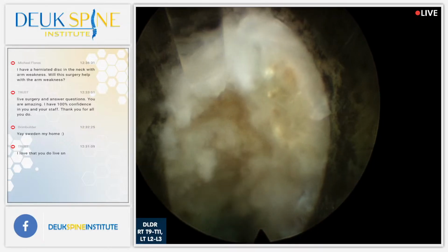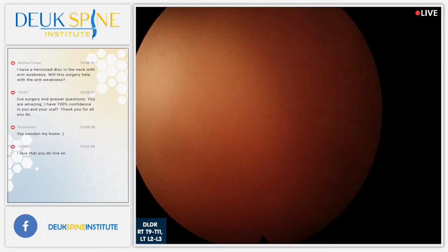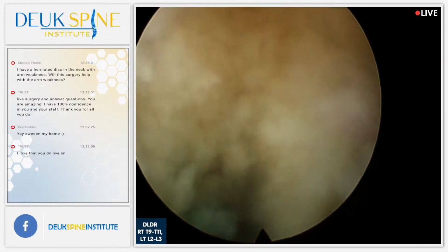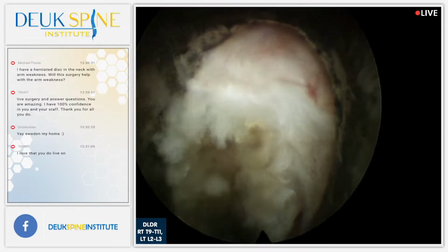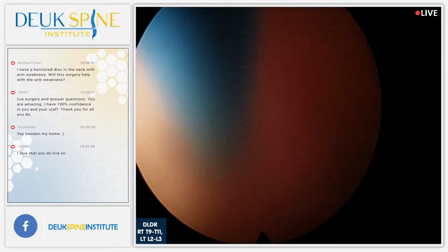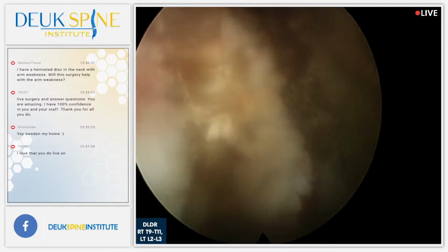All right, just about done here. I'm surprised. Look at all the scar tissue. We couldn't tell based on the discogram, could we? The discogram and the MRI did not show any of this. The MRI showed none of it. Zippo, zero. Show them the MRI if you haven't already seen it. That disc looks almost normal.